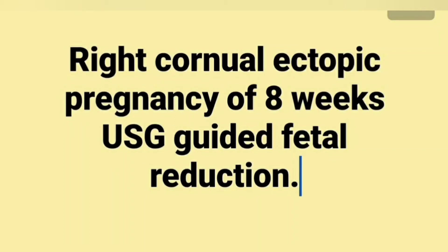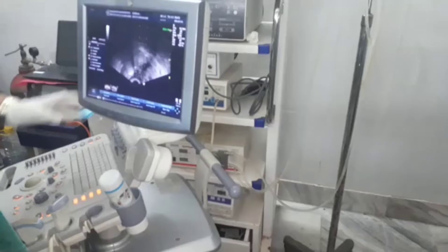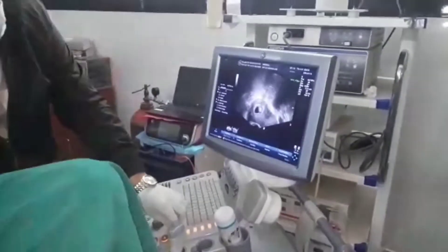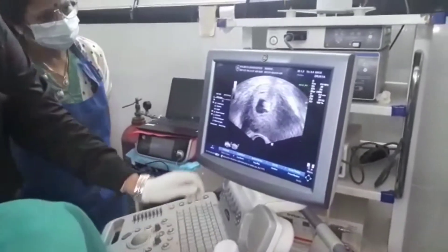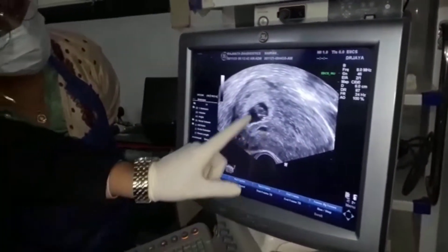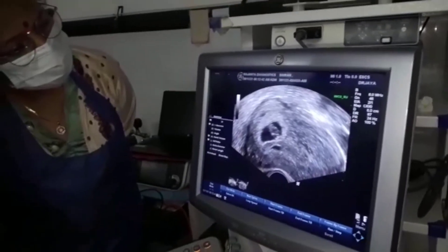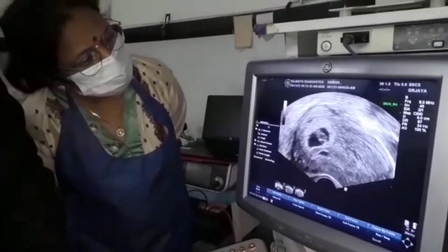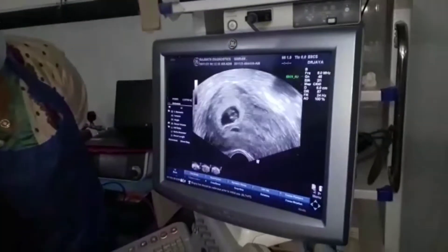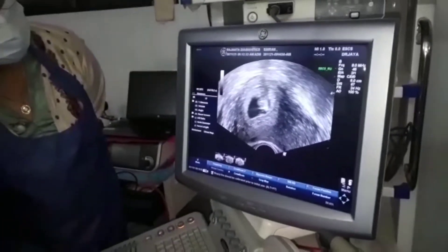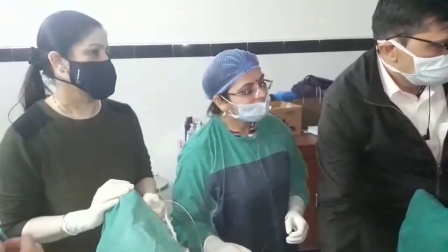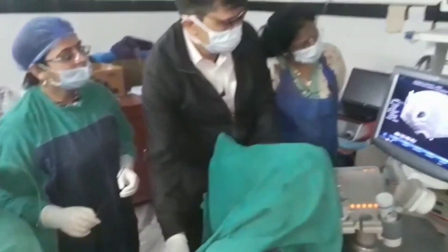Good evening. This is a case of right cornual ectopic pregnancy of 8 weeks. We are going to do fetal reduction to prevent cornual rupture and the catastrophe of ectopic pregnancy. With good ultrasound nowadays we can diagnose it very well. By the time the myometrium was thinned out, we planned the fetal reduction.